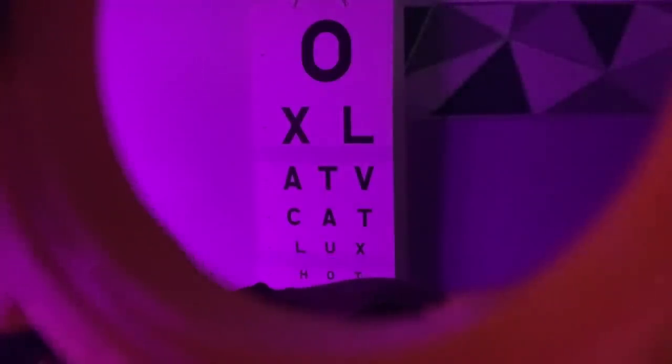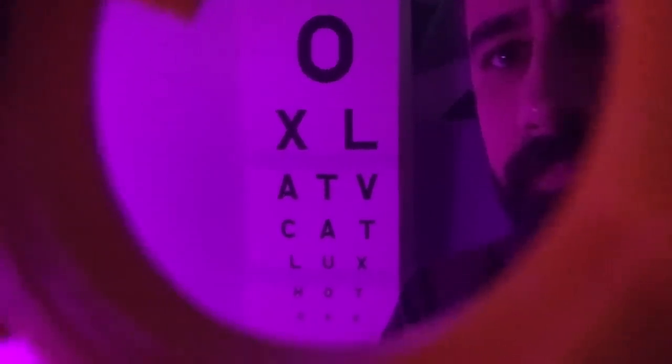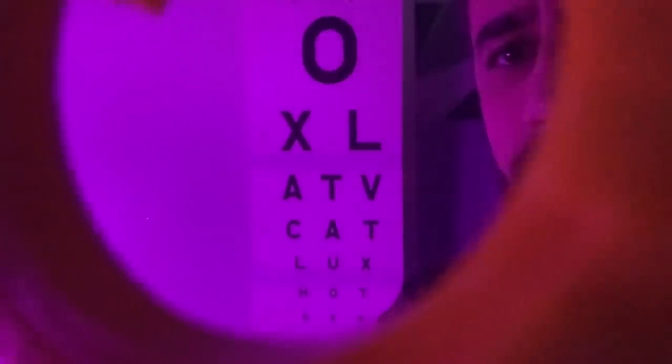Okay, just looking into the distance while I have a little look with the retinoscope. Just sweeping the light in different meridians. And maybe changing the lens around. I just want to place a plus 2 diopter sphere into the frame. Let's just move the trial frame across on you. There we go. Keep looking into the distance, please.